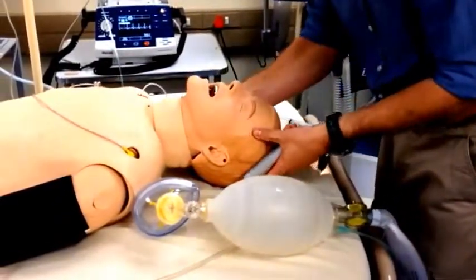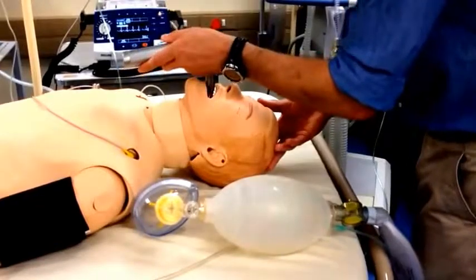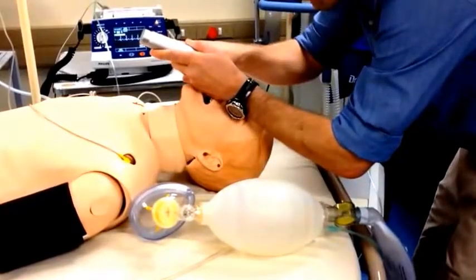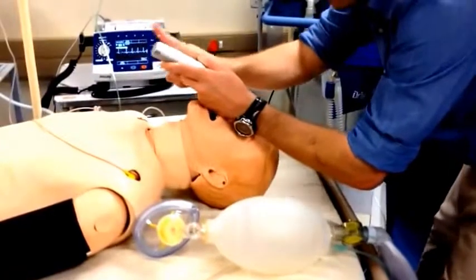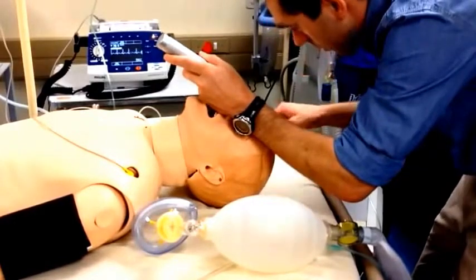Position the patient gently and slide the blade of the laryngoscope into the right side of the mouth, deflecting the tongue to the left. Gently advance the laryngoscope blade along the tongue, pulling in the direction of the handle, taking care not to tilt. As you advance and pull the tongue up, you'll visualize the vocal cords.